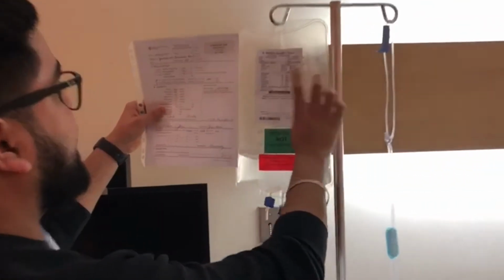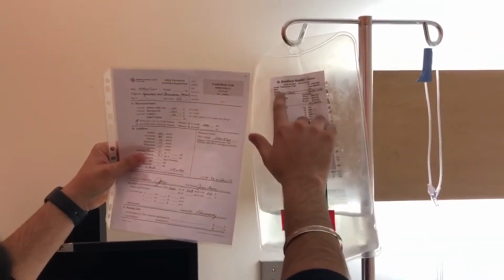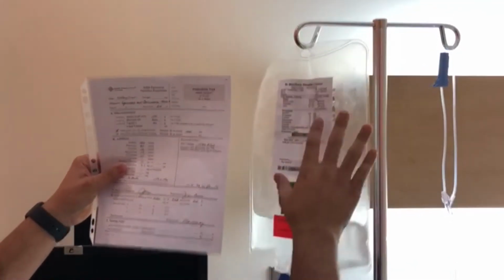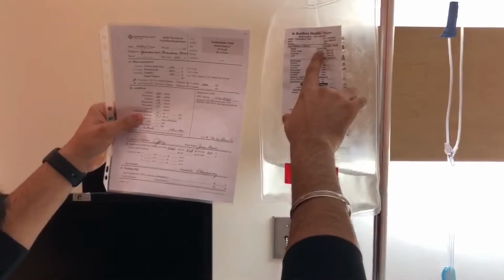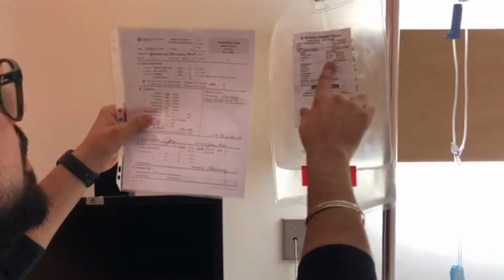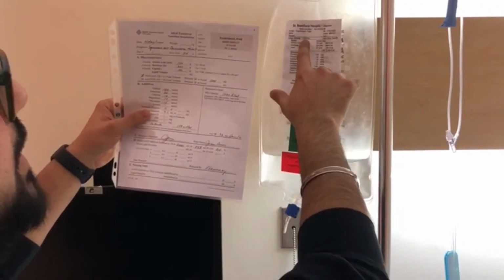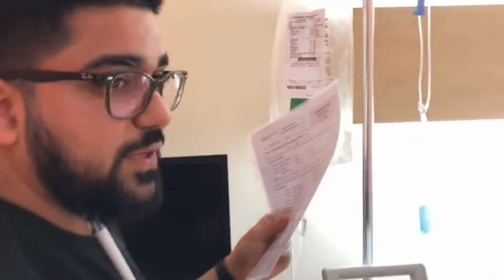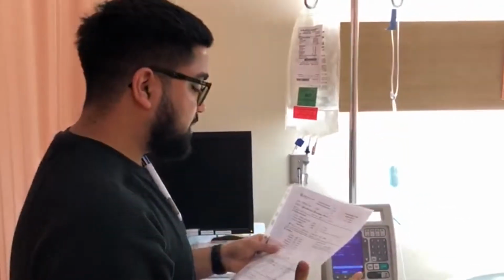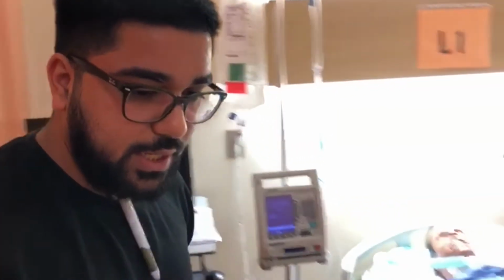So I can come here and compare this first. I can look at the patient. So we have Fred Fredrickson there. MRN is not stated here, but we are verified that the name is correct. We can look at the amino acids, so 100 grams. We have 100 grams there, 200 grams of dextrose there, lipids 50 grams there, and our total is 2,000 mLs, which we have there. So this is verified. If we needed to verify this, we can also verify with the second nurse. And so that's verified. So we can go ahead and start the administration.